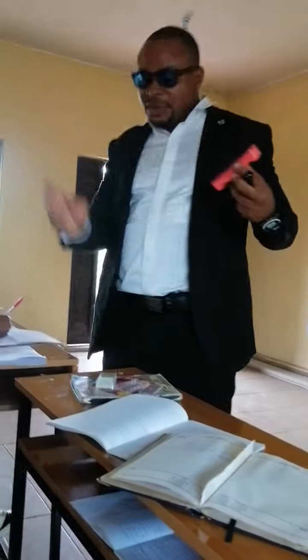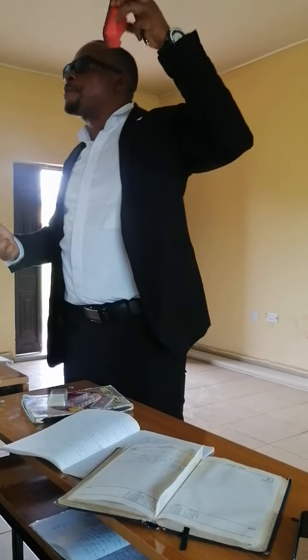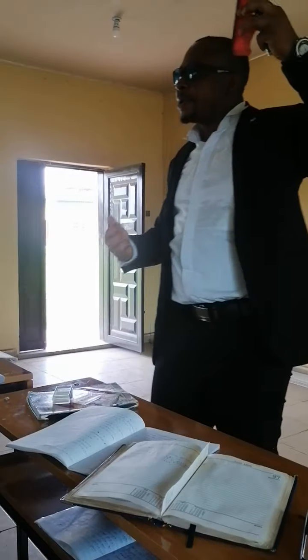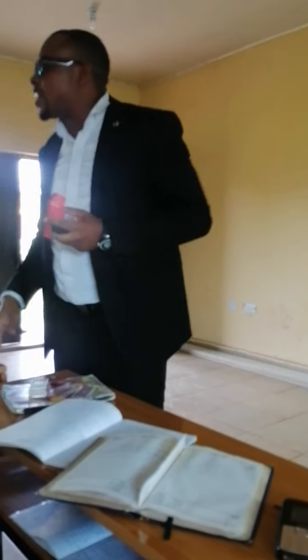Don't forget, when you mix your 0.02 mL of blood with the diluent, be it formal citrate, ammonium oxalate, or Turk's solution, you mix it properly. You know why? For platelets, let me tell you one thing about platelets. Platelets have a strange character.